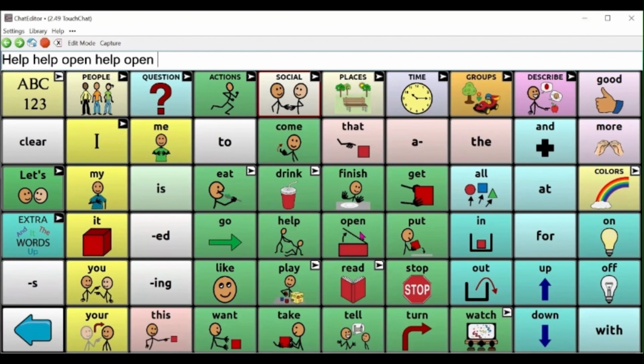It can be difficult, especially when children have ways of communicating with you. They know that I can take your hand and indicate what I want that way, or that you already know what I want. And so it's hard when we're adding a more sophisticated tool to add those words because eventually we want them to use those words that everyone is going to understand. As they get older, we don't want someone just pulling on us to indicate that we want something. We want them to use those words.